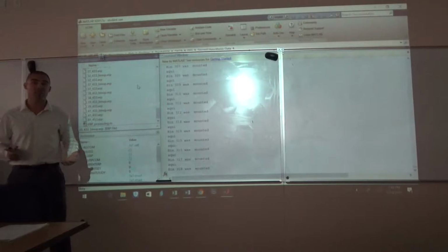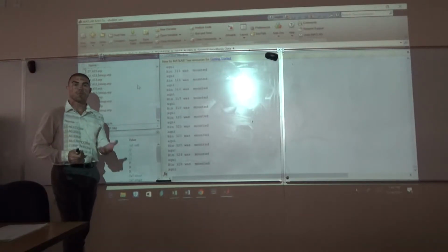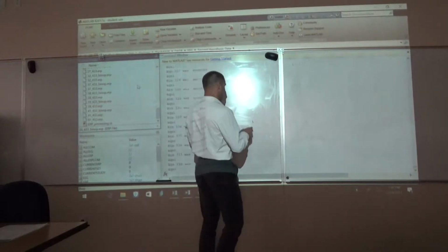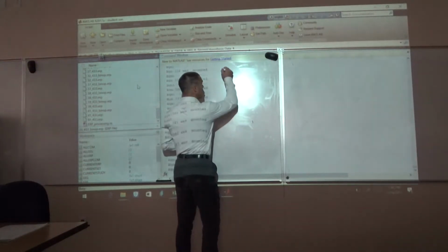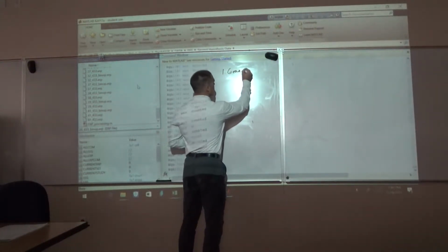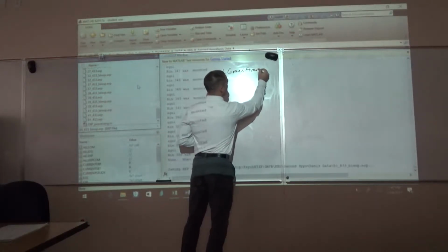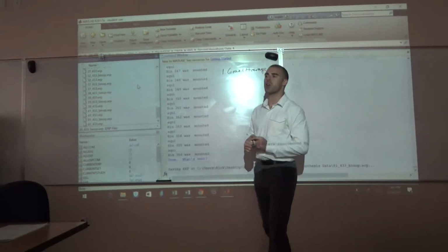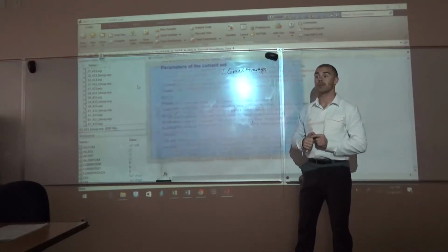Once that's done, somebody mentioned it earlier, what we want to do is create a grand average, right? When you create your grand average, you're going to have to create it for different groups.